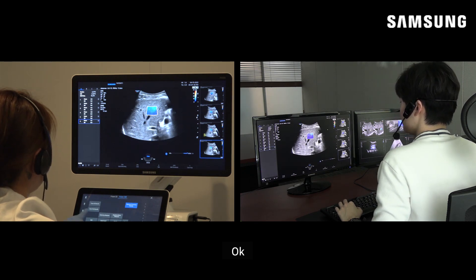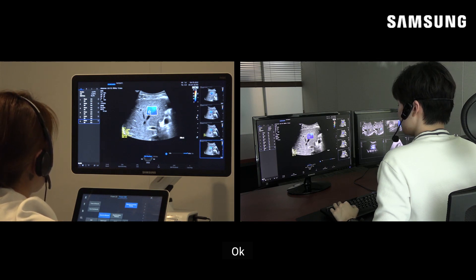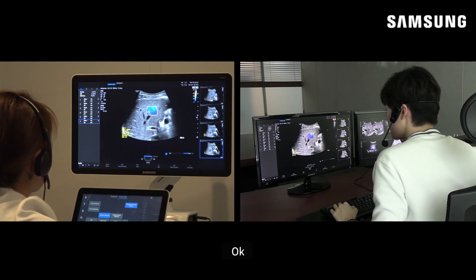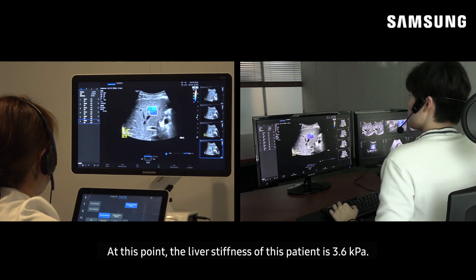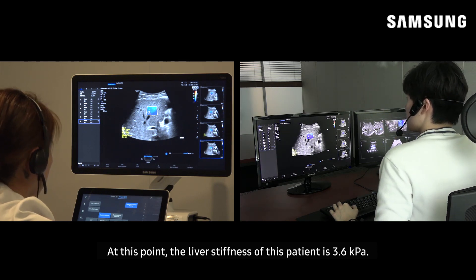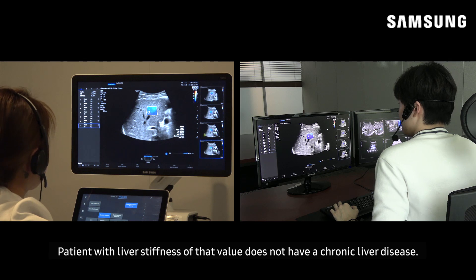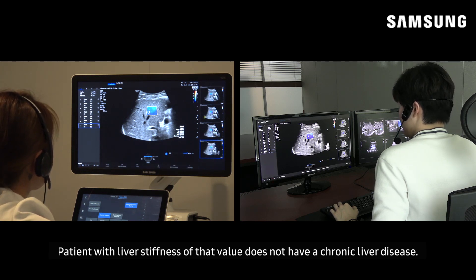Okay. At this point, the liver stiffness of this patient is 3.6 kilopascal. A patient with a liver stiffness of that value does not have a chronic liver disease.